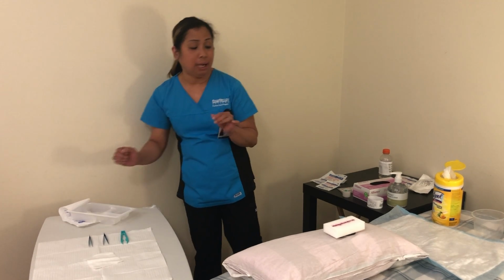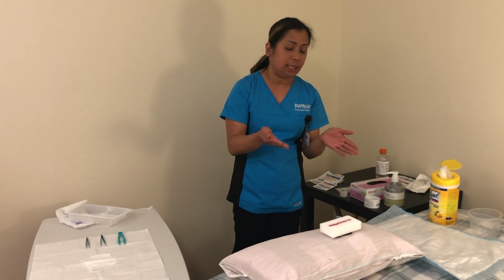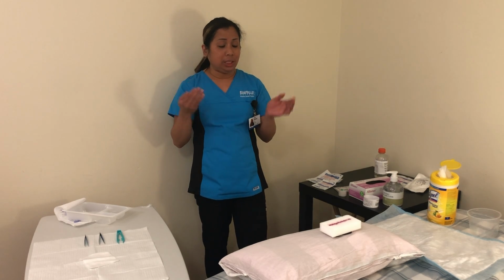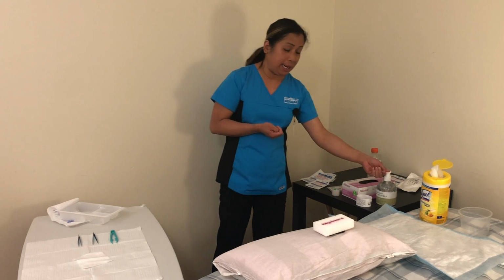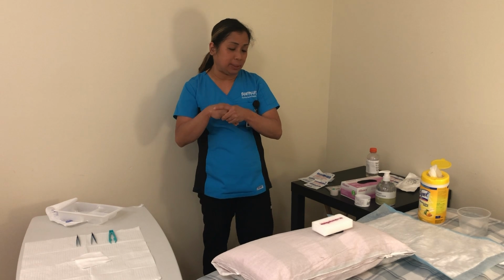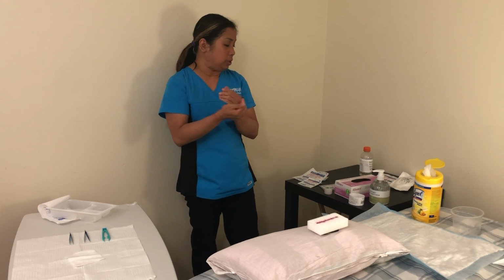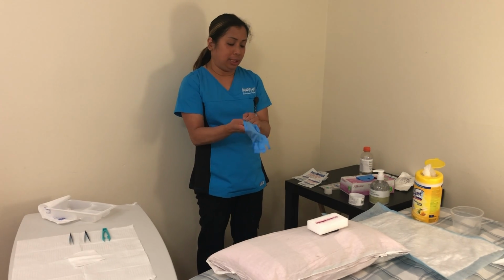All right, now, assuming that I've done cleaning the wound, and I did already the assessment of the wound, what I'm gonna do now is the staple removal. Before the staple removal, I will wash my hands, because I will use non-sterile, clean gloves, as a protocol that you have to wear gloves when you remove the staples. So I will put my clean gloves on now. So this is my clean gloves.